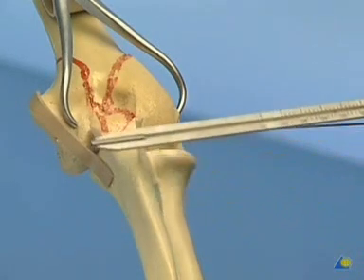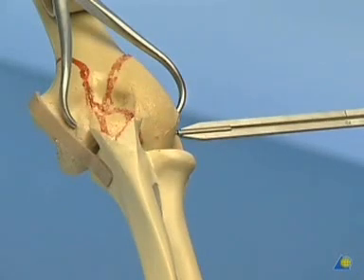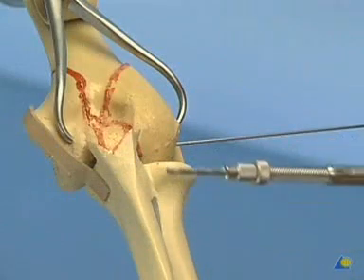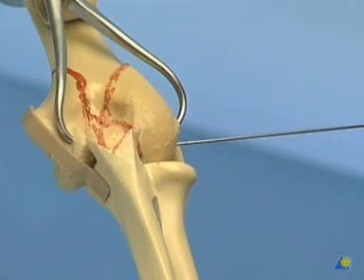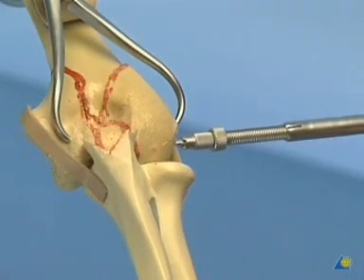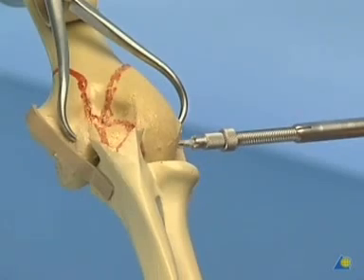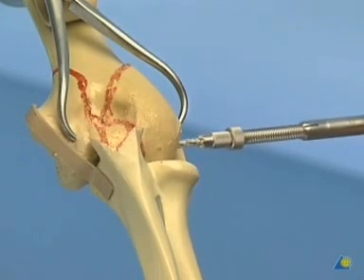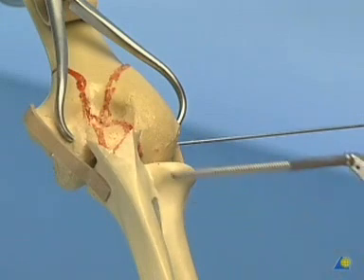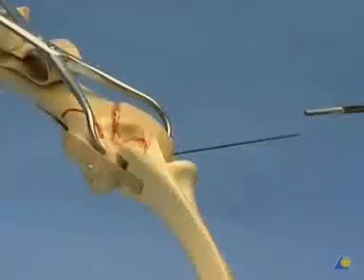The length of the cannulated 3.5 mm cancellous screw is measured with the special measurement device, taking into account the short bit which was cut off. The hole for the screw is prepared with the cannulated drill bit. The special drill sleeve with stop may be adjusted in order not to penetrate too far across, which may lead to loss of the reduction or the K-wire being pulled out. The cannulated tap is used only to give the screw a good start in hard, cancellous bone.